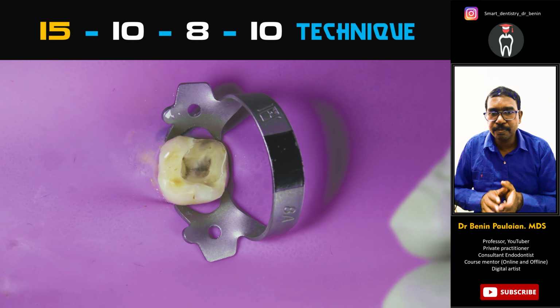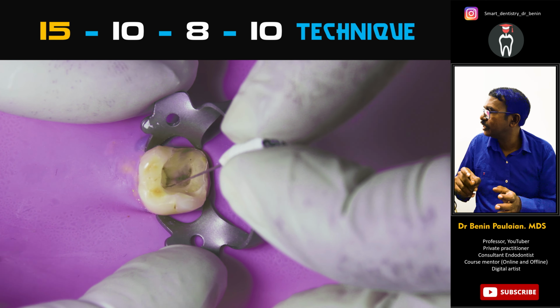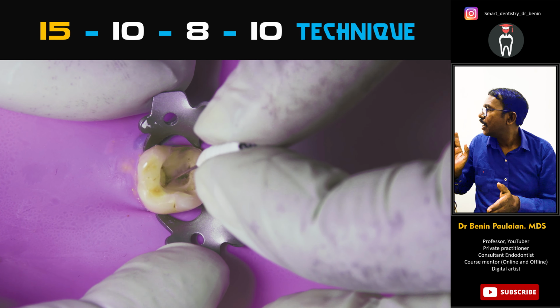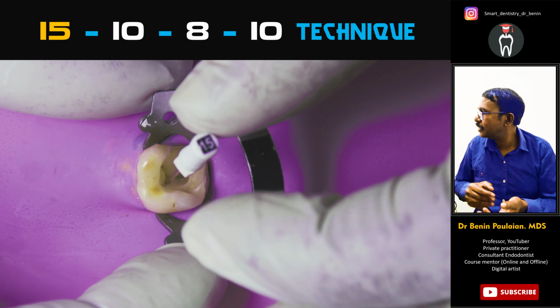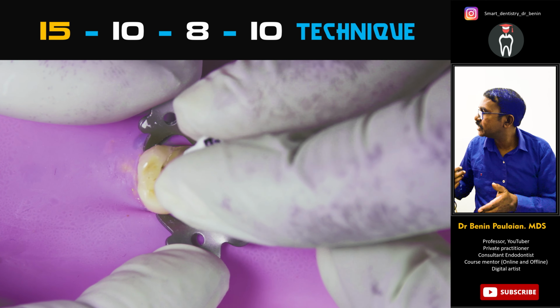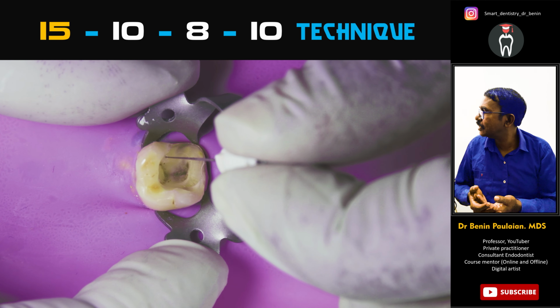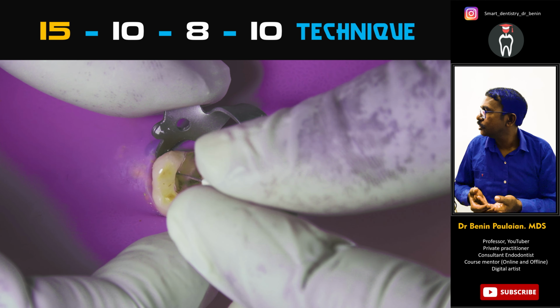If you are pushing, you are going to block the entire canals. So the mesiobuccal and the mesiolingual I have negotiated to the coronal 1/3, and now the distobuccal and distolingual we shall do just the same. The coronal 1/3 enlargement we can do.